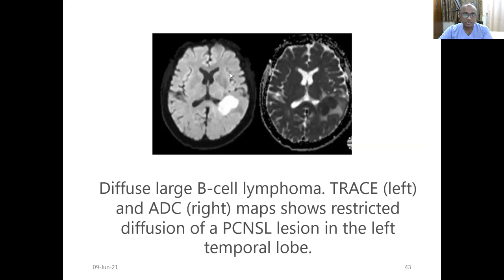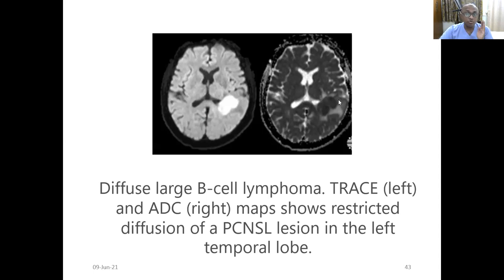On diffusion weighted imaging, due to lymphoma hypercellularity there is restriction — you will see a hyperintense area in the lesion. Correspondingly on the ADC map you can measure the low ADC value, which appears dark. Remember: higher ADC value is good; low ADC value indicates more malignancy. ADC is also helpful for prognosis and response assessment after chemotherapy.